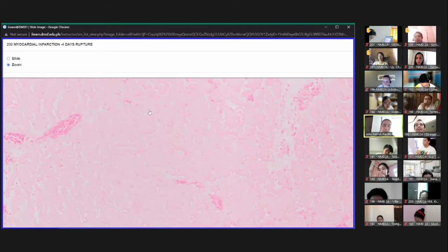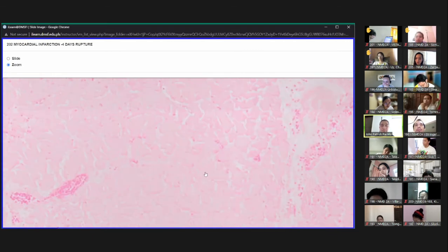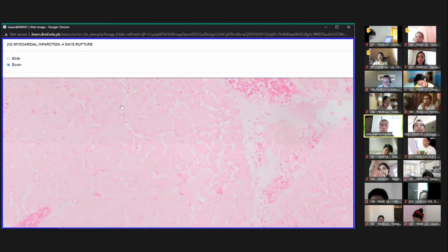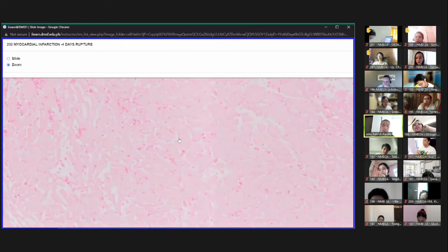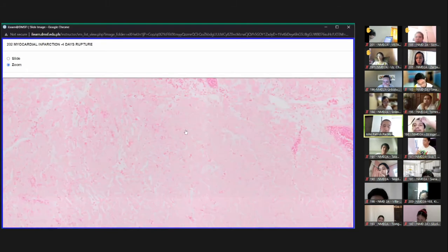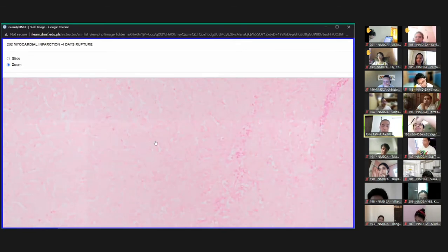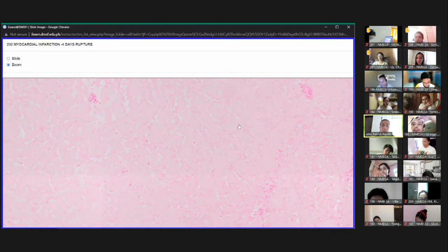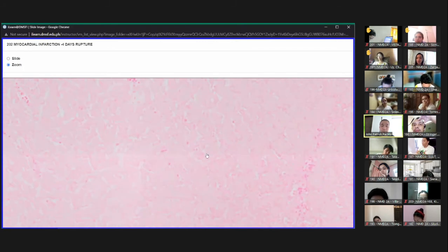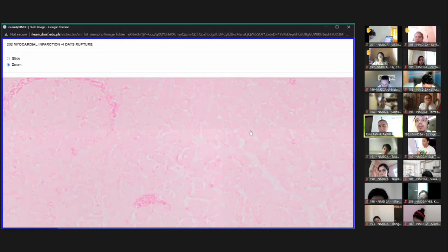Of the cardiac myocytes because of the lysis, it has been eaten up by portions of the neutrophils as well as the histiocytes. Yeah, so very important. Okay. So all the areas here would show the presence of the ghost outlines. Okay, but there's disintegration already of the myocytes. Yeah. Very important. Yeah. So it means that this is more than 3 days old.